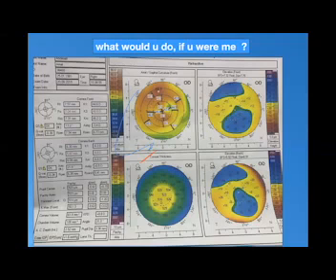Yes, it is a point of suspicion, but the patient is still having a good best corrected visual acuity, and at the same point, the thinnest location is steep, which is 48.3. The anterior elevation is minus, and the posterior elevation in that point is minus. But you will go for PRK, right? Right.